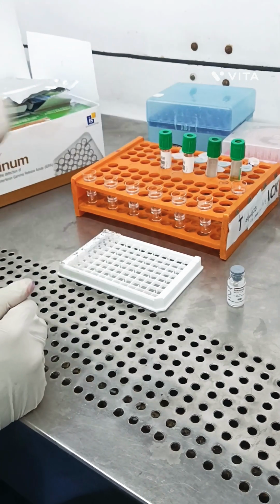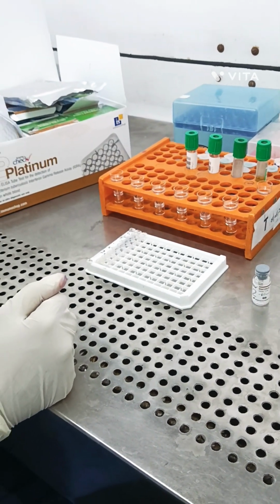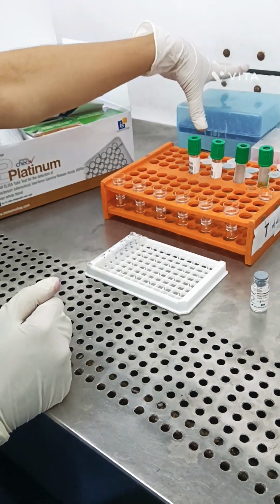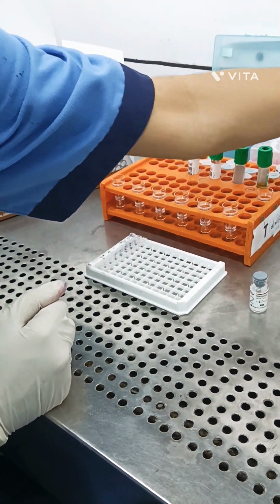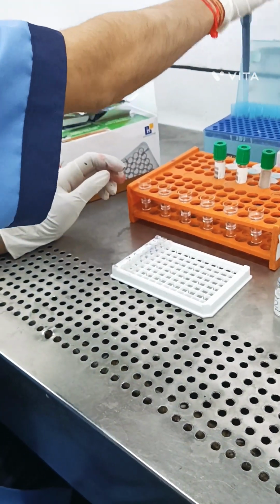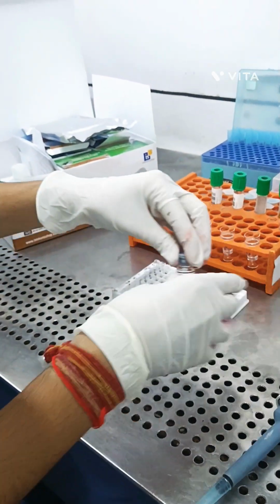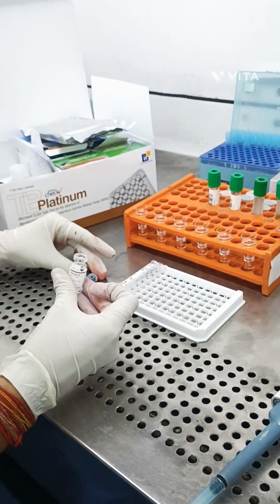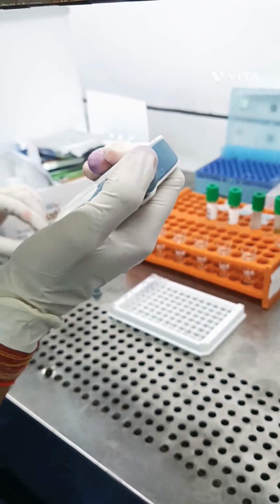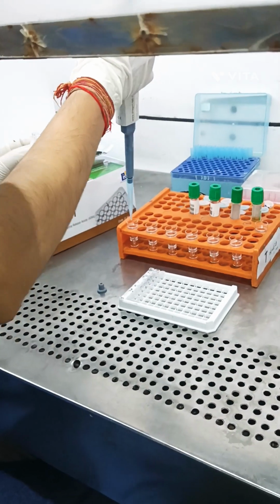After that, take 6 tubes. In the first tube, transfer 200 microliter from the standard ampule, the 400 concentration.